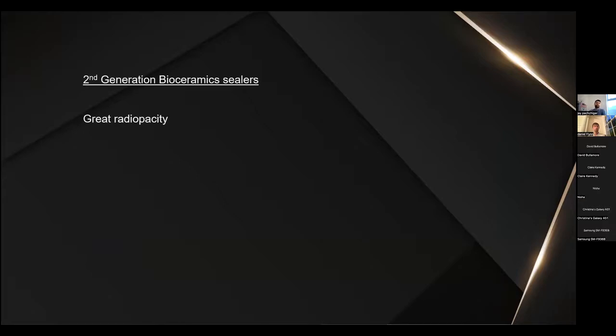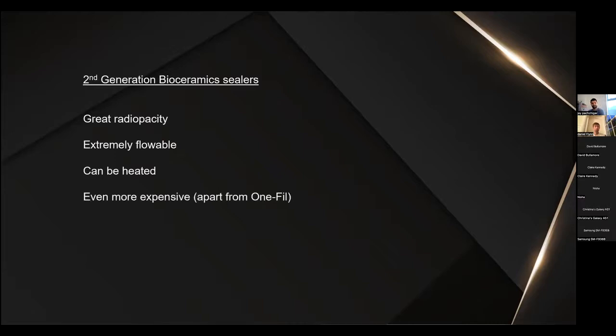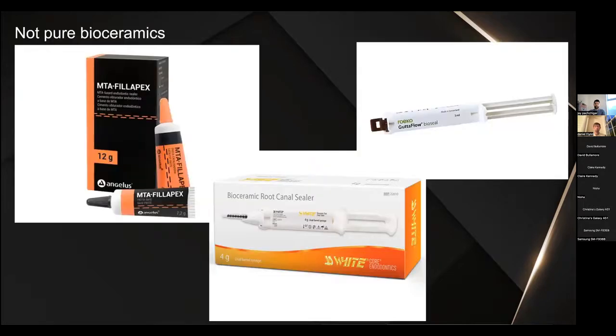So these are much more radiopaque. Subjectively, they look a lot better on a post-op. They are very, very flowable, and it does take time to get used to this. They can be heated. It's not advisable to heat them 5 mils from the apex. It's not really needed so much, but a few mils of downpack, it can be done. But apart from One-Fil, these are all now much more expensive than their first generation ones. But thankfully, we do have One-Fil at a much more reasonable cost.